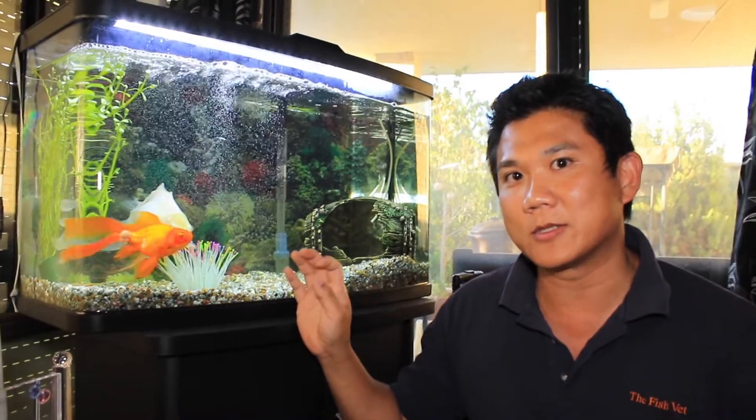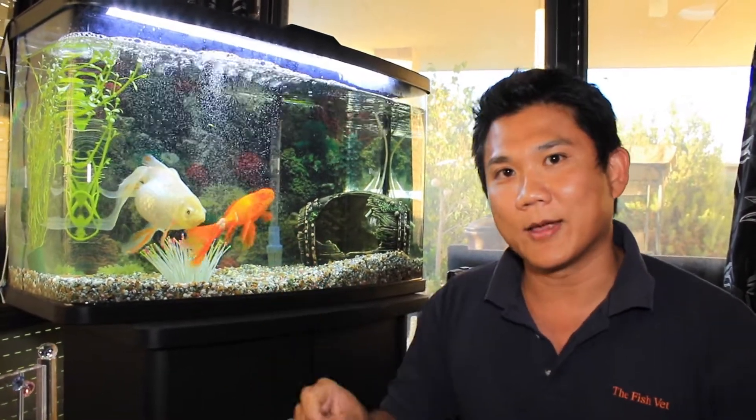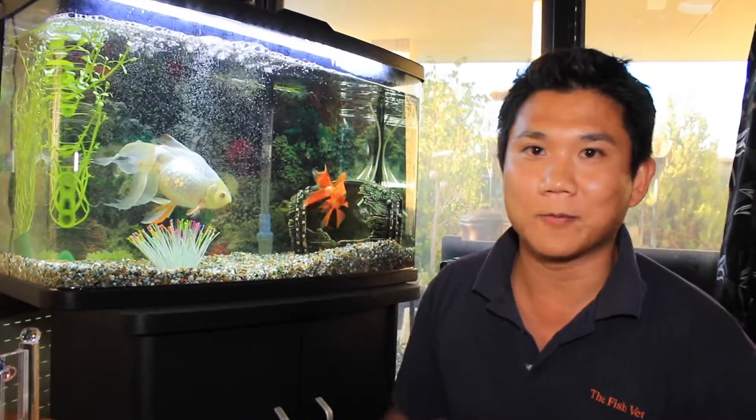The one on LJ is going to be a fairly simple procedure to remove. Basically they're going to anaesthetise her and then remove the fin ray just before where the growth starts, and then the fin should regrow and heal up very simply without any complications.